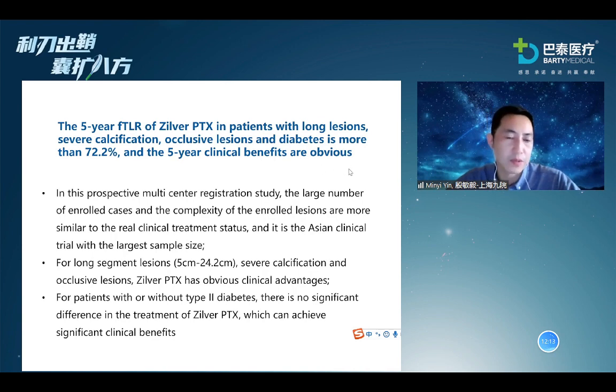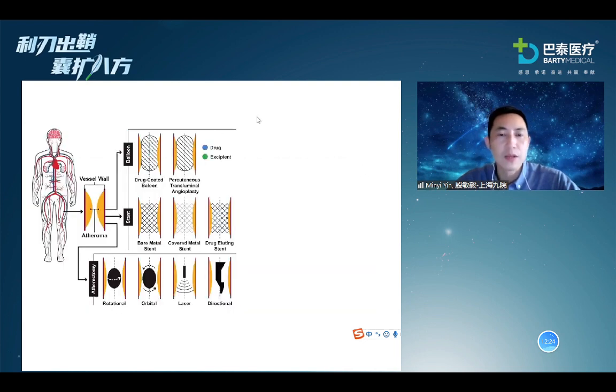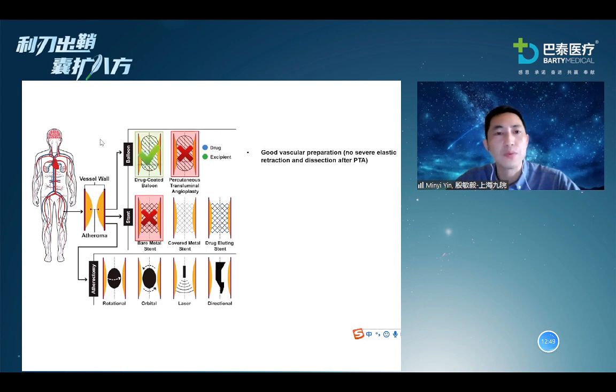And conversely, when we need to use such a stent, especially for the complicated lesions, if we use DES compared with the BMS, the results will be better. In summary, for the FEMPOP complicated lesions, previously, we only did balloon dilation, and after that, we deployed a stent. Actually, the results may be poor. The mid to long-term patency is not so good, and the new devices, DCB and debulking device, they all have their benefits. However, they have different conditions.